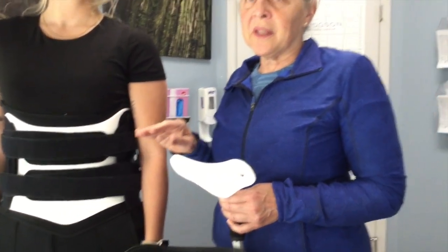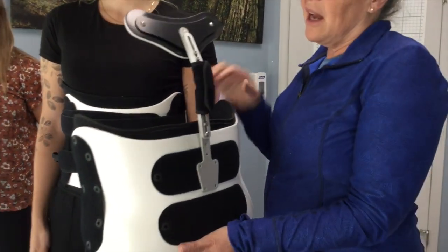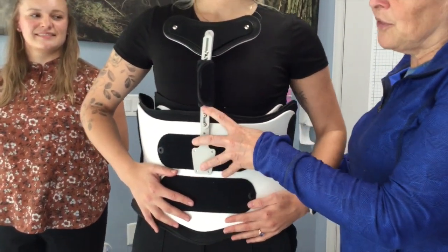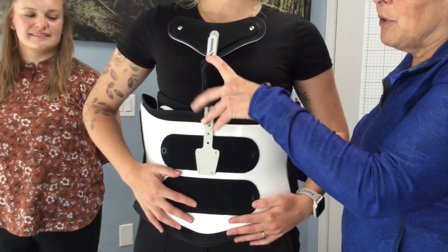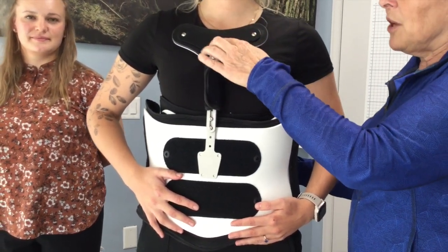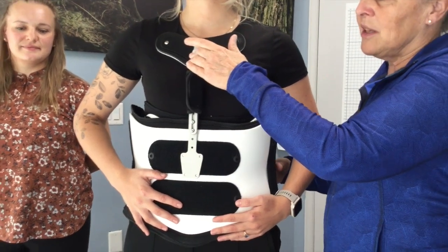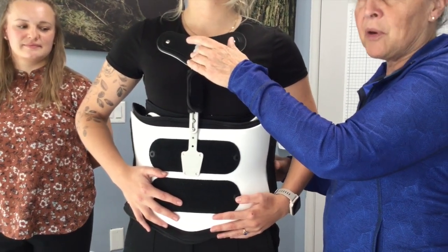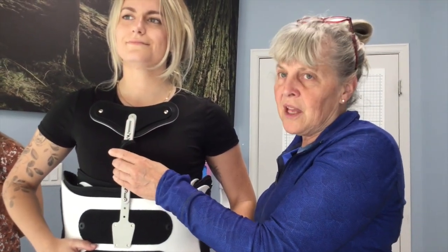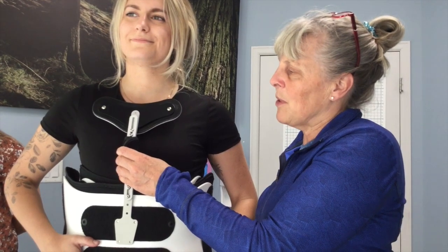Sometimes there will be two-level fractures — something in the lumbar region as well as the thoracic region. We can use this brace with a modified version that has a thoracic extension. All the same steps that Amber just went through apply, and this would be how the front looks. We would adjust for this to sit just below the sternal notch, under the chin, and make sure it is looking after both lumbar and thoracic regions. That is just another version of the Edge LSO, which now becomes a TLSO.